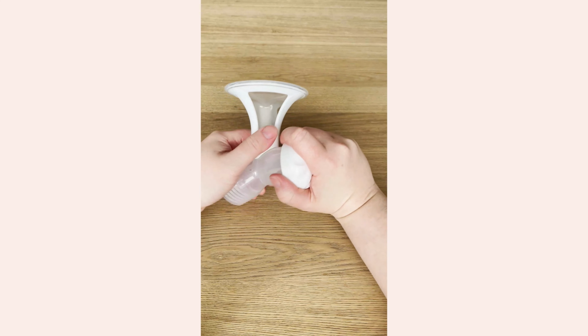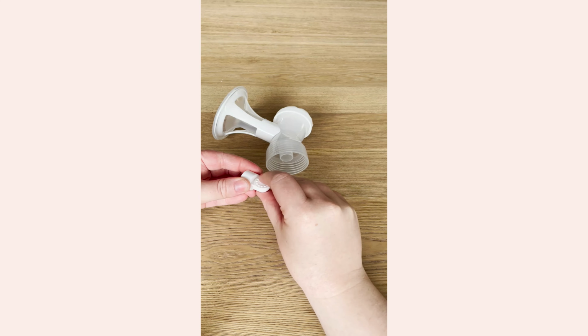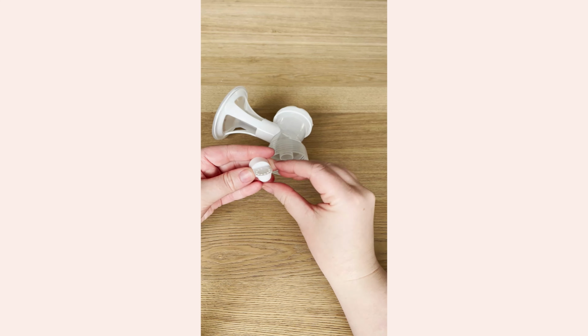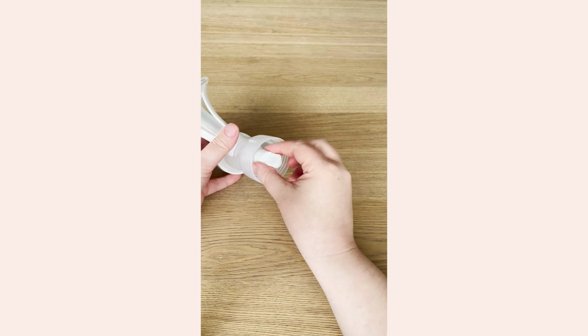Take your valve and ensure the membrane is sitting flat on the body. You may need to gently remove it to check over for any tears and damage, and wash it in warm soapy water to remove any milky buildup or oily residue that may prevent it from sitting flush. These components work together to create your suction.